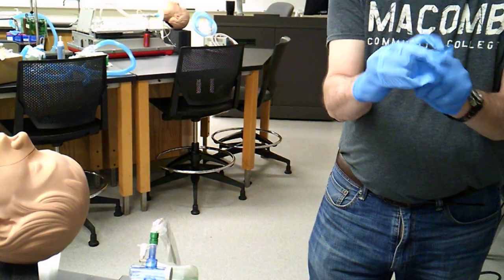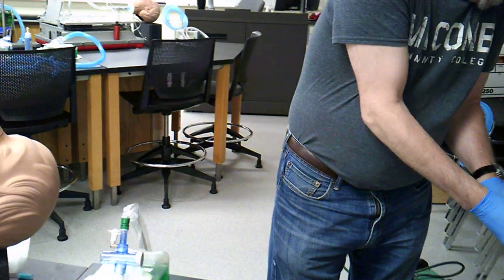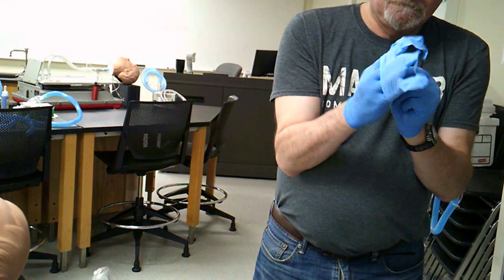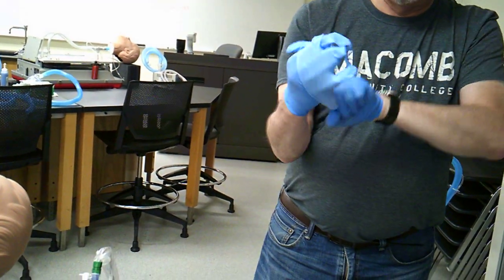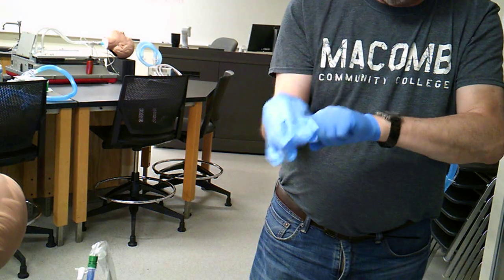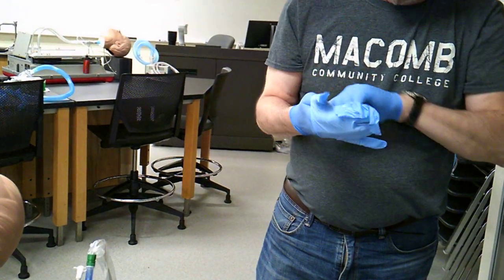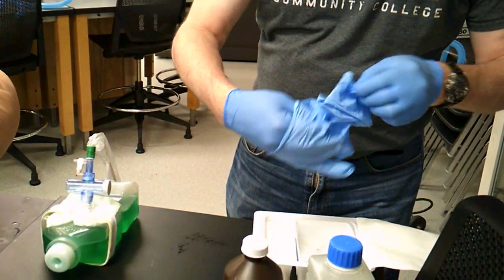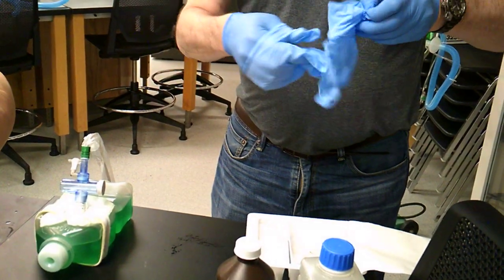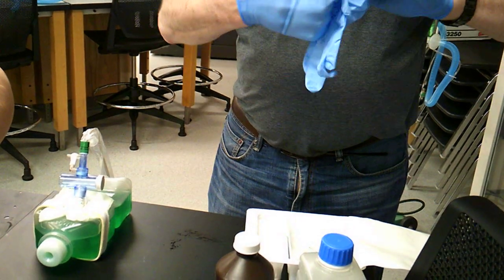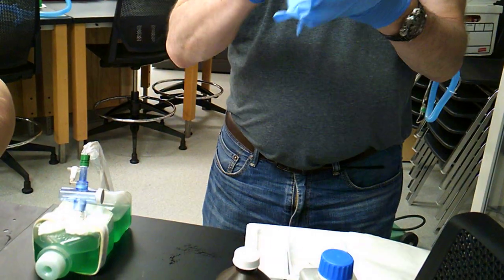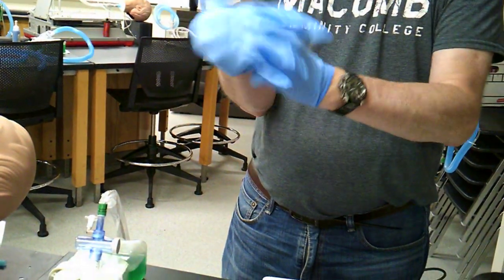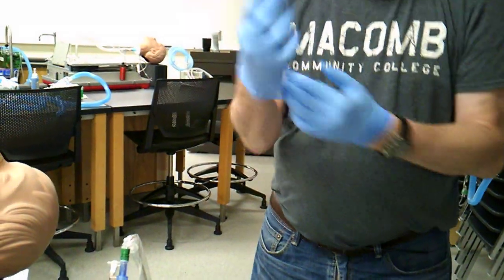If I can get these on my hand with a glove on. Challenge. It kind of helps to not hit my fingers there. Get that one adjusted once I get this glove on. Okay.